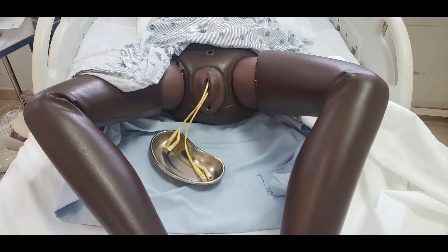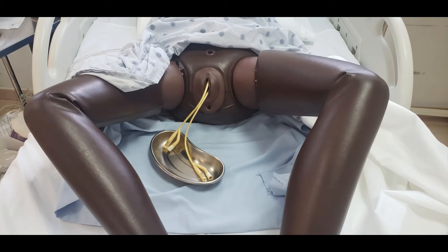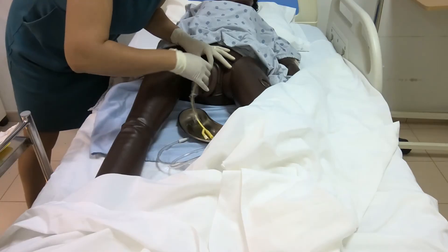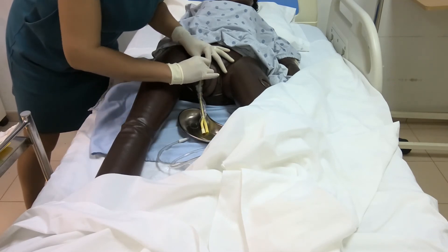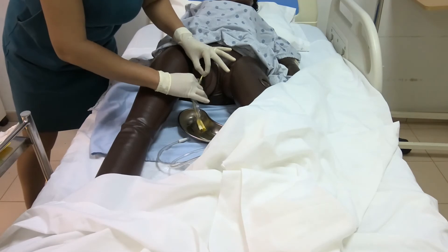If the catheter is inserted into the vagina accidentally, it is considered contaminated and it cannot be reused. It can be left in the vagina until a new catheter is inserted to help with avoiding the same occurrence. When you have urine flow back, be sure to advance the catheter another 2 or so inches to accommodate for the distance from the opening of the urethra to the balloon, which we will want to inflate inside the bladder. This avoids injury to the patient.